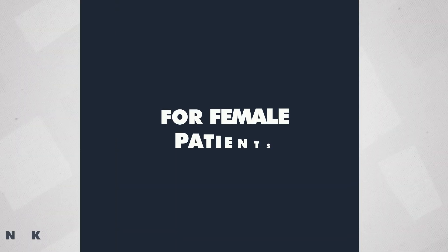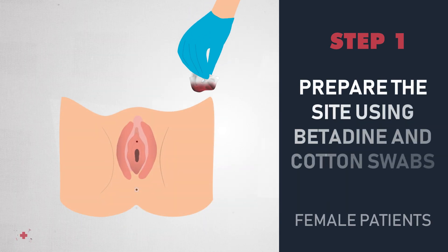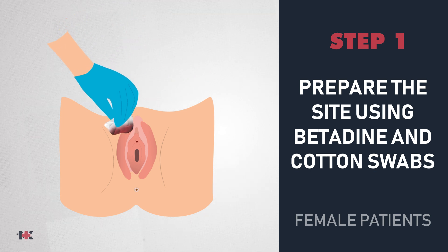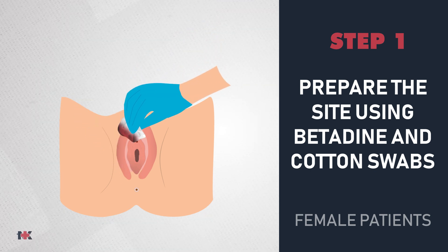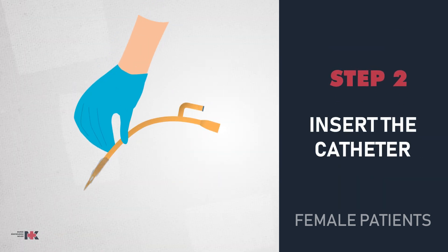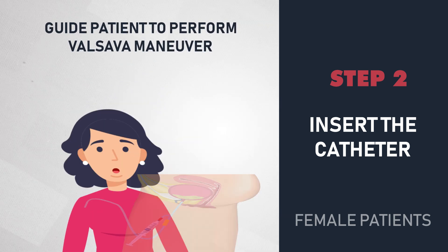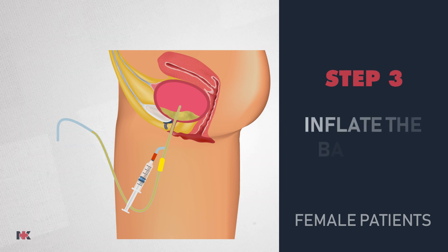For female patients, we'll use the same approach with the cotton swabs and betadine. With the swabs, we're going to go through the labia majora left and right, and then through the middle with the last swab. Then we will insert the catheter. Compress the catheter tubing five inches from the tip. Ask the patient to bear down and then insert, advancing two to three inches until urine appears. When urine appears, advance a little bit more and then confirm it is patent.